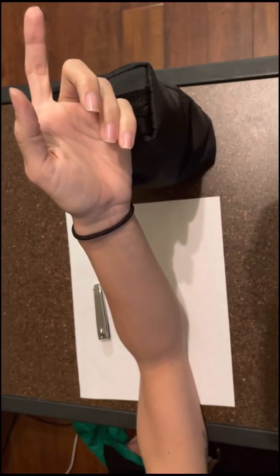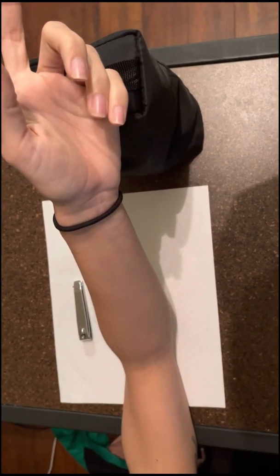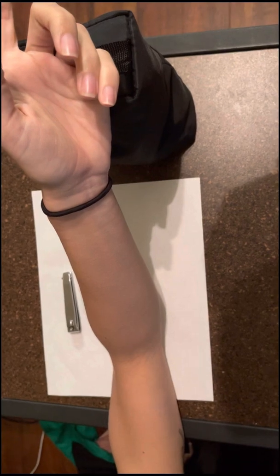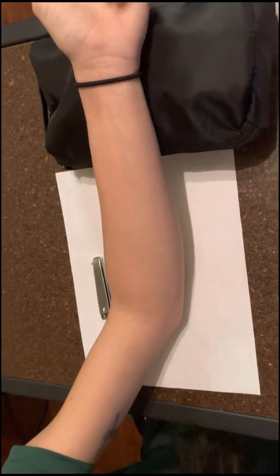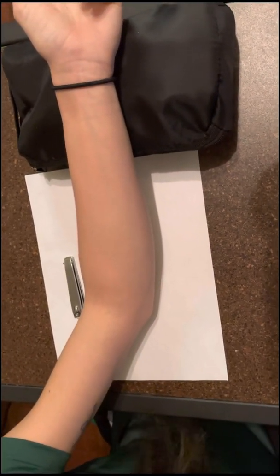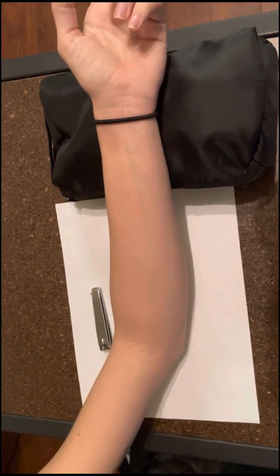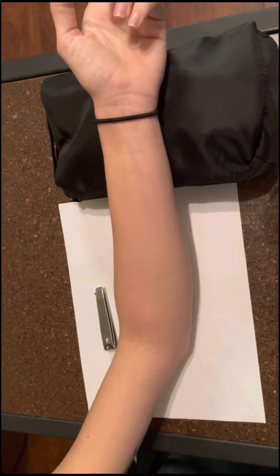For the Jones elbow, the distal humerus is parallel to the film, centering the condylar area of the humerus. It may be necessary to provide support for the patient's arm. For the proximal radius and ulna, place the dorsal surface of the forearm on the film, centering to the elbow joint. The central ray is perpendicular through the elbow. Anatomy demonstrated is an AP projection of the distal humerus and proximal radius and ulna in separate exposures.